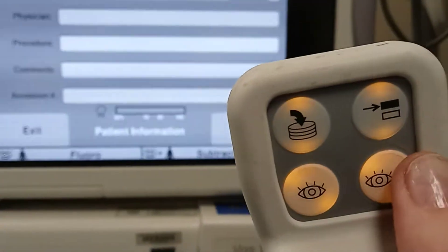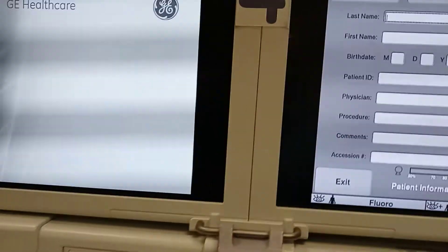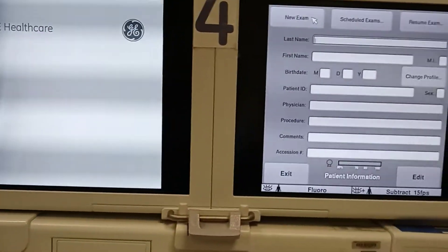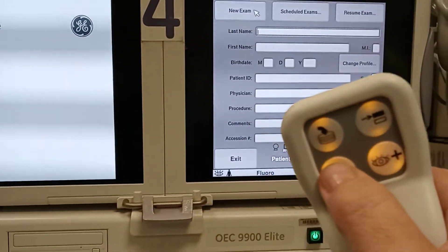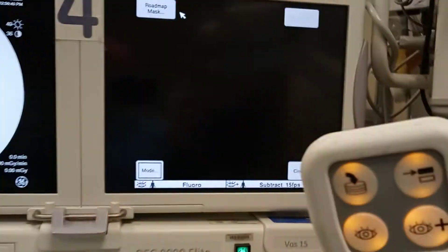Now I'm going to go ahead and take a quick image, make sure we look good. This is localizing. Am I in the right spot? Yes.